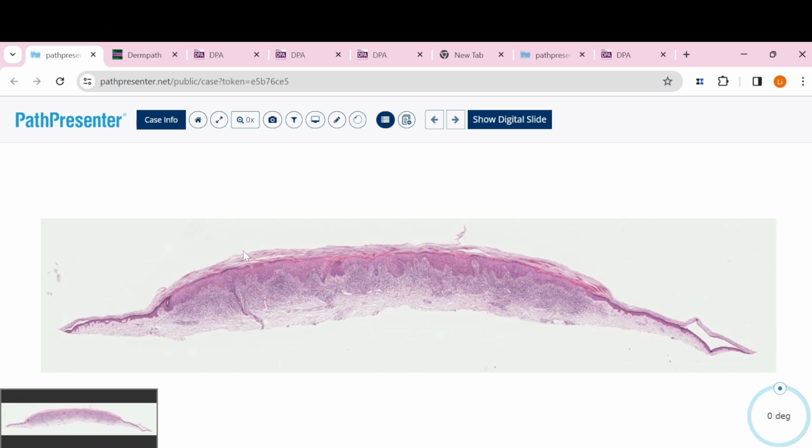So I think some people are always kind of confused about lichenoid changes. When they see tons of lymphocytes in the dermis, they will say this is lichenoid changes. But truly, lichenoid interface changes means we not only find tons of lymphocytes in the dermis, but another thing we need to see, you can see in this DEJ junction, you just could not draw a really clear line between the epidermis and the dermis. When you see these changes, this is true lichenoid interface changes.